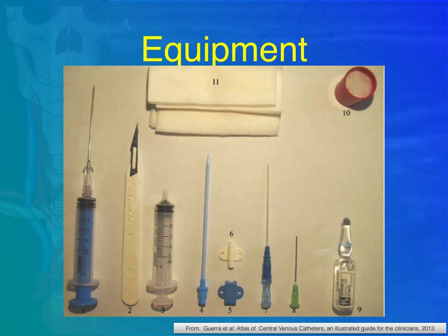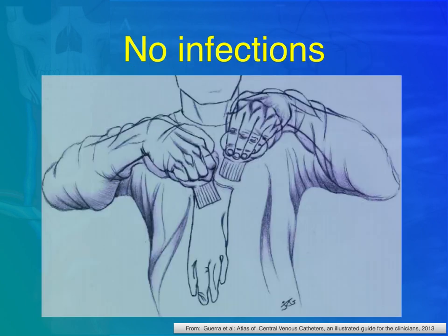The vessel will dilate with the catheter alone. Also, you will find a clip to fix the catheter, 5 and 6, and a syringe for lidocaine. Place all your sharp equipment on the container named as 10. You can see there is a sponge there. You can just put all the needles there, and you will have some 4x4s in 11. In the carts, you will find more 4x4s if you need them.